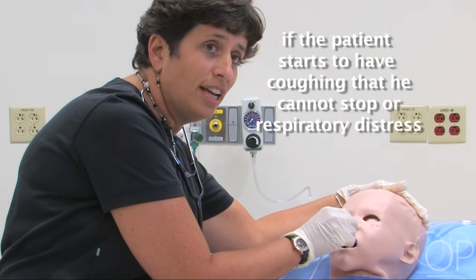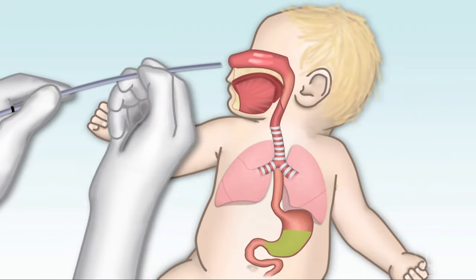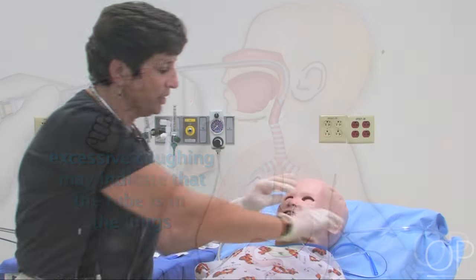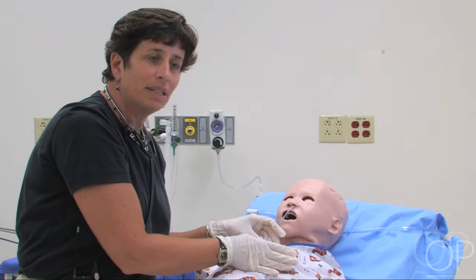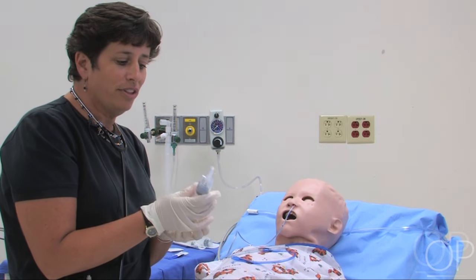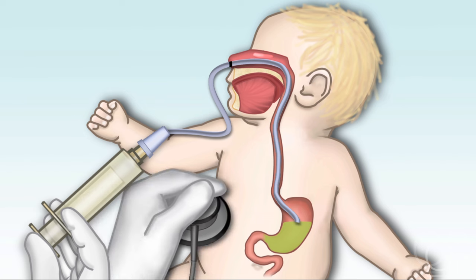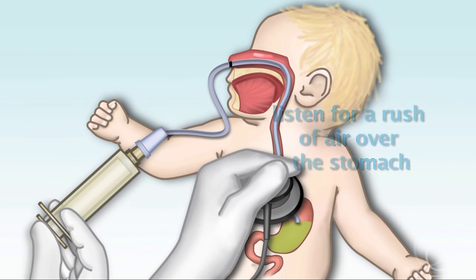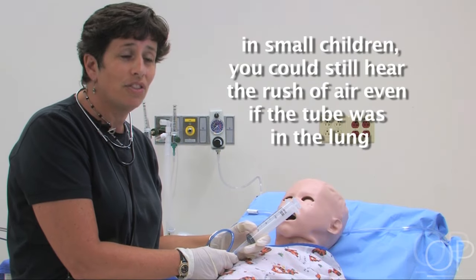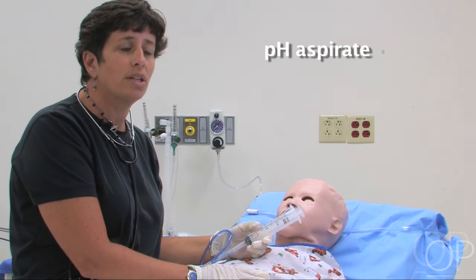If the patient starts to have coughing that they can't stop and they appear distressed, immediately pull out the tube and allow the patient to recover. Excessive coughing can be a sign that the tube is actually heading into the lung instead of the stomach. Once you get the tube into place, you want to confirm placement. The first way is to put 5 to 10 mLs of air into the belly using a catheter tip syringe and listen with a stethoscope over the stomach for a rush of air. Remember that in smaller children, you could still potentially hear that rush of air even if the tube is in the lung, so you need a secondary method such as getting a pH aspirate or an x-ray.